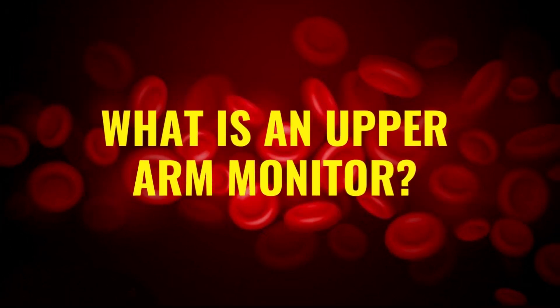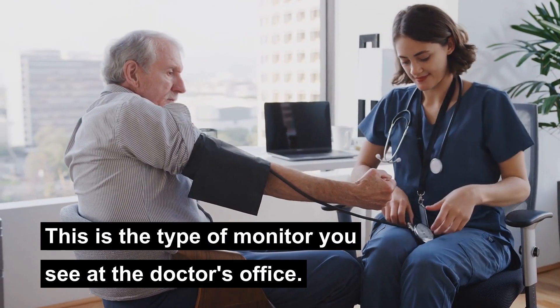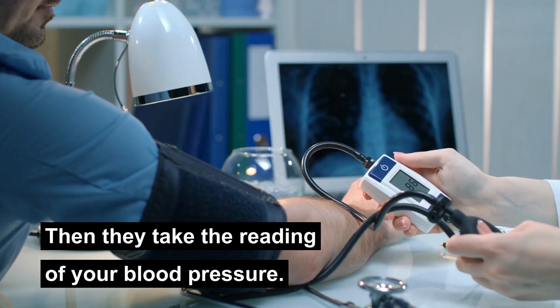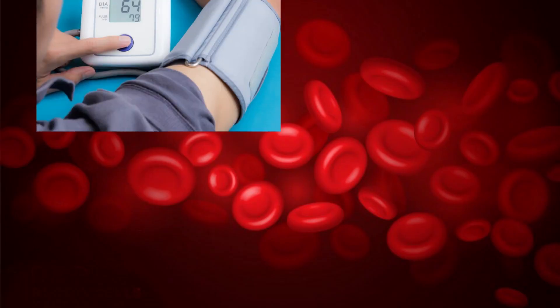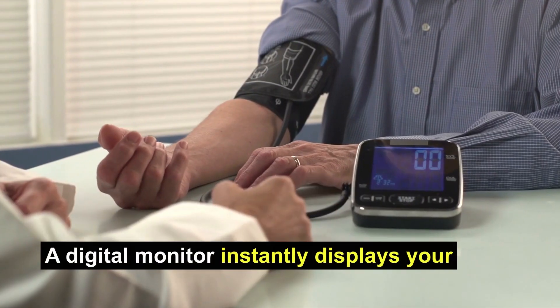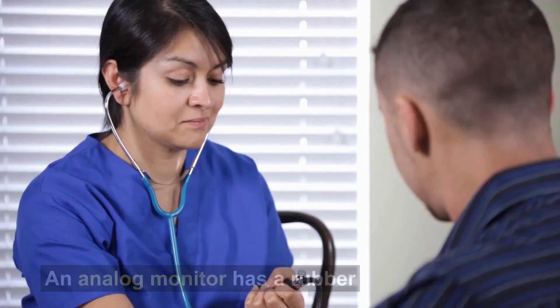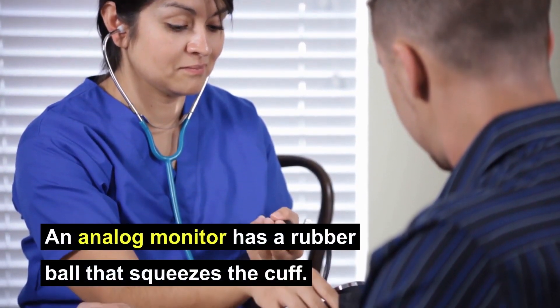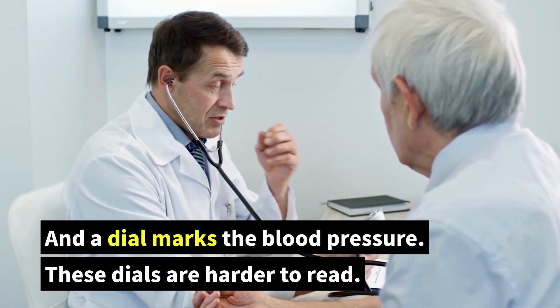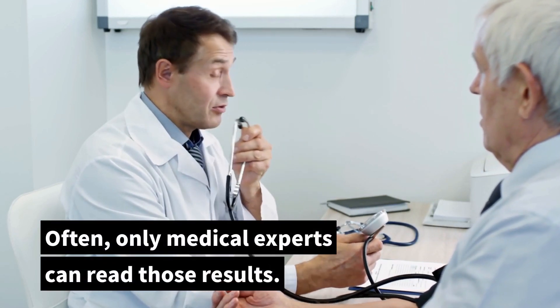So what is an upper arm monitor? This is the type of monitor you see at the doctor's office. It has a cuff that the doctor wraps around your upper arm, then they take the reading of your blood pressure. An upper arm monitor can be digital or analog. A digital monitor instantly displays your blood pressure on a handheld screen. An analog monitor has a rubber ball that squeezes the cuff and a dial marks the blood pressure. These dials are harder to read — often only medical experts can read those results.